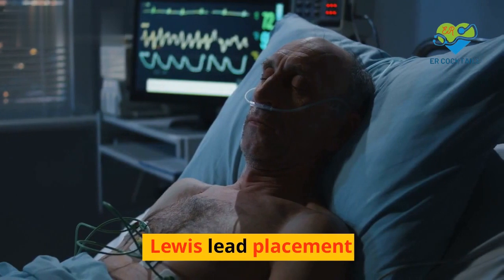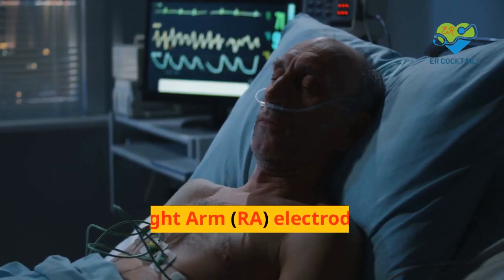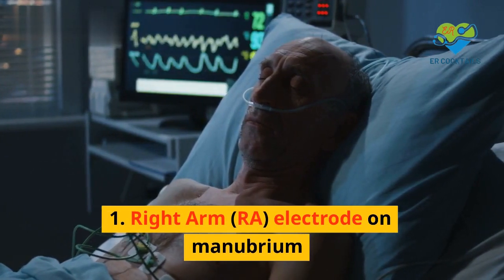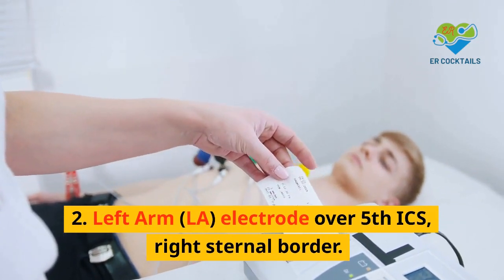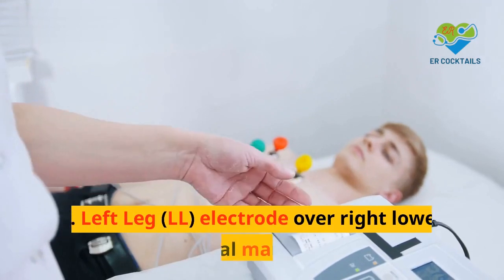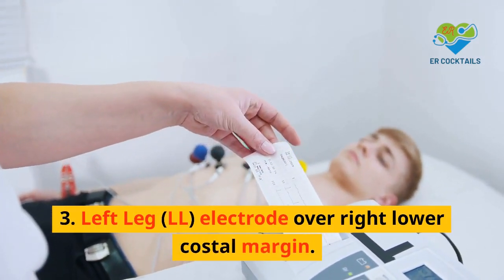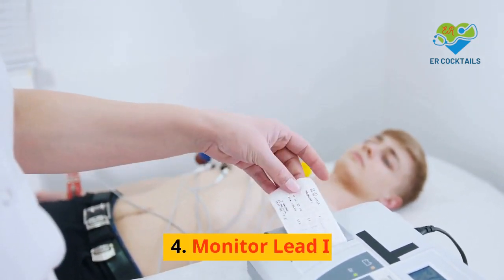Lewis lead placement. 1. Right arm, RA, electrode on the manubrium. 2. Left arm, LA, electrode over the 5th ICS, right sternal border. 3. Left leg, LL, electrode over the right lower costal margin. 4. Monitor lead I.